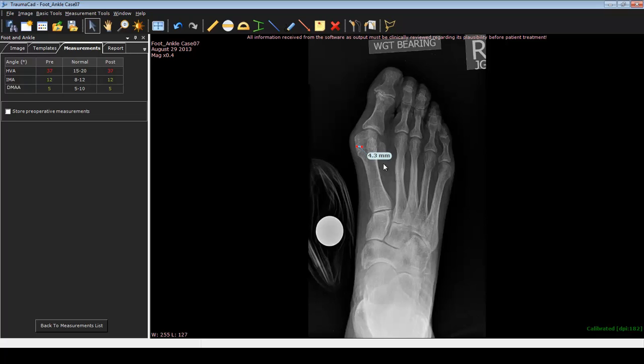the fibular sesamoid. So that's just a little bit of, if you're using this method to teach residents or other practitioners that are learning how to do this, this is a very good tool they can use for evaluation of their metatarsal deformity. Secondarily, what I also use this tool for is to let me know how to make soft tissue correction and how much soft tissue correction I need to make. Even though we're measuring bony deformity, this program is very helpful in soft tissue evaluation as well. And I can show that to you as we make the correction itself.